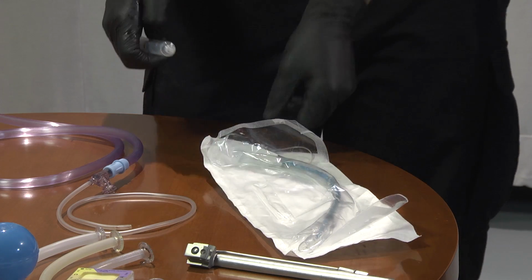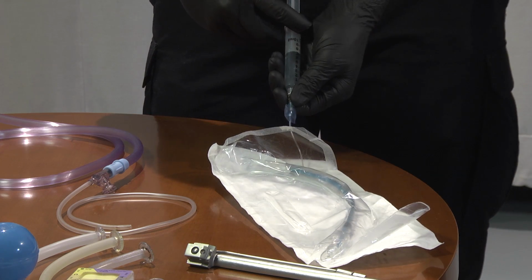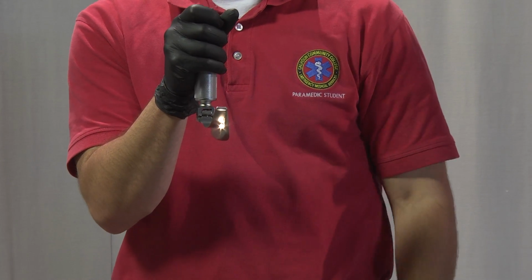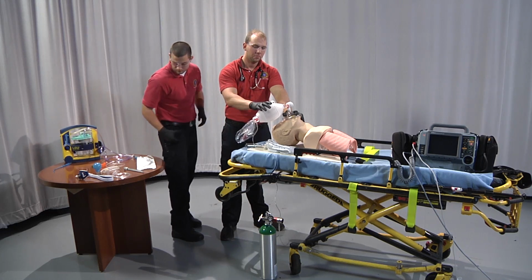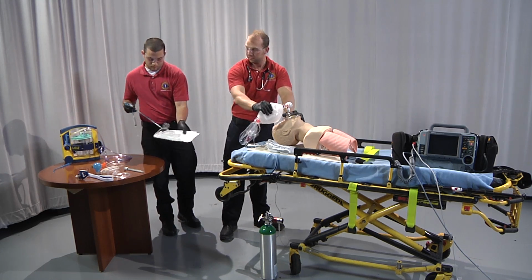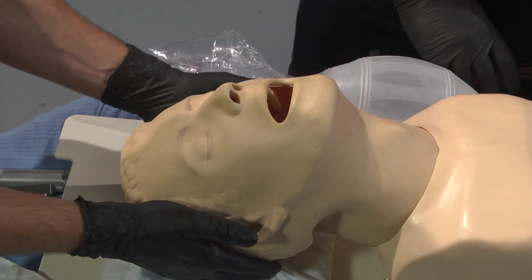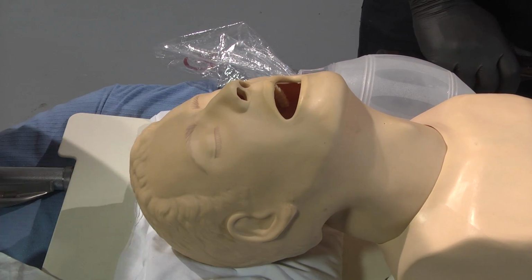Attach syringe and test cuff inflation. Be sure to remove all air prior to insertion. Ensure blade bulb lights up and is securely attached. Once all equipment is readied and pre-oxygenation has been accomplished, stop ventilations and remove the simple adjunct as necessary. Position the head in the sniffing position with the head slightly elevated. Ensuring proper alignment will increase the chance of successful intubation.